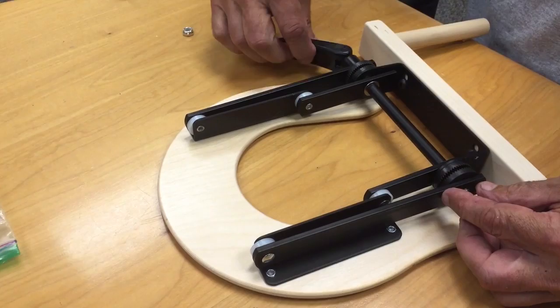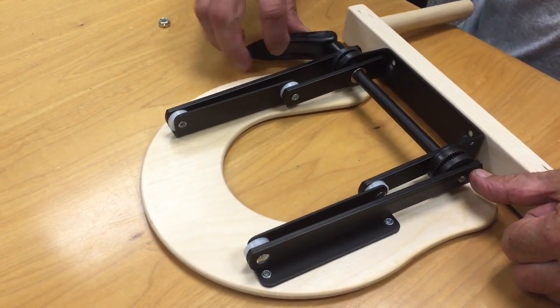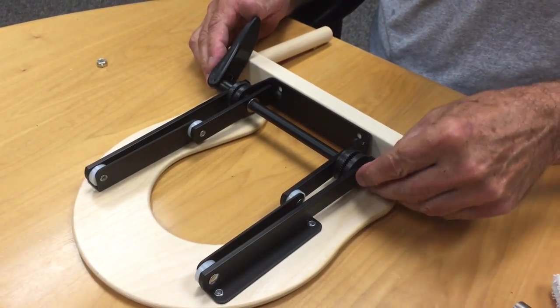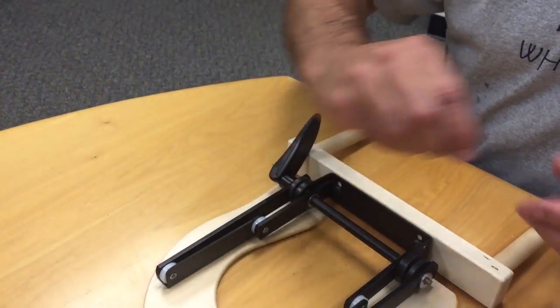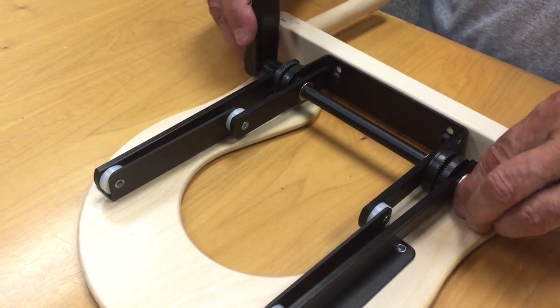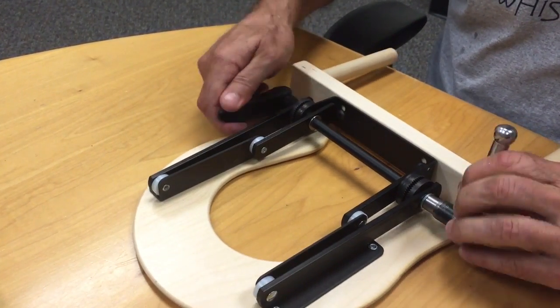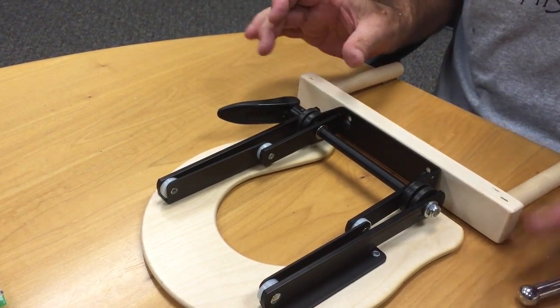Now, if your handle is this way, you'll notice I don't have enough room to get a nut or anything on there. So that's why you must have the handle in this position to allow enough space to apply your thick washer as well as your new nylock nut. Then tighten slightly, but in this position you do not want to tighten all the way till everything is tight.